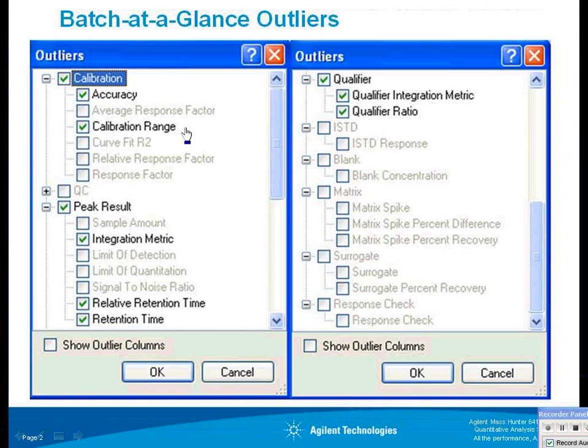There are also other outliers which are not turned on, and I'll show you in a moment how to set limits for them and make them active. We cover metrics associated with the calibration curve, like the average response factor, the curve fit R squared, relative response factor. And to monitor your samples, we can flag up sample amounts, limit of detection, limit of quantitation, signal to noise. And with other sample type groups, we can monitor an ISTD response, blank concentration.